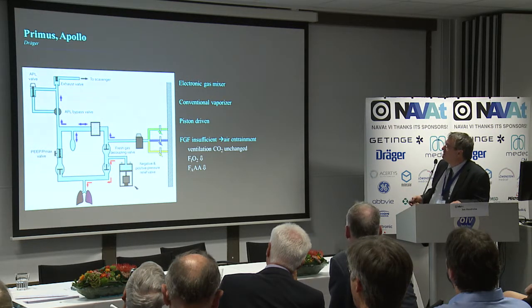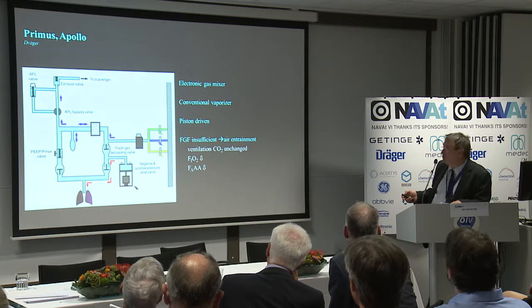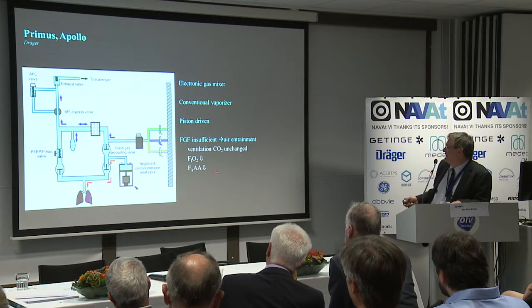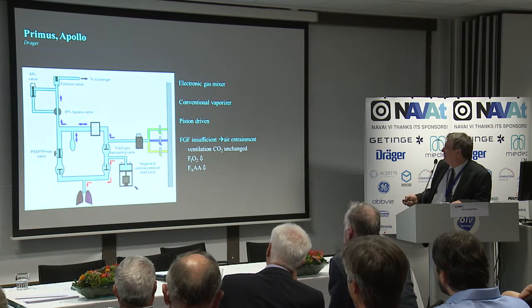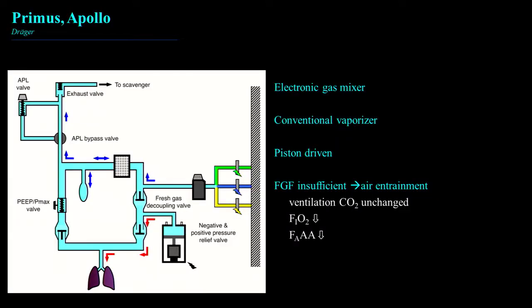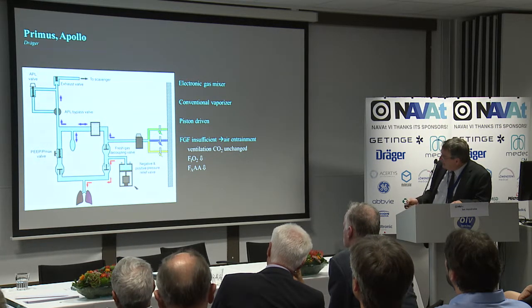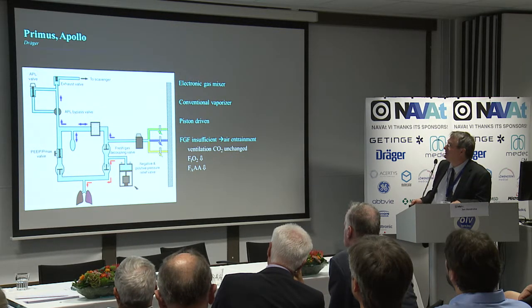Now let's have a look at the Primus Apollo. Please correct me if I'm wrong. This again has an electronic gas mixture with a conventional vaporizer. It's piston driven, and if you switch off the fresh gas flow, air will be entrained and used to ventilate the patient. Then of course you have to watch your inspired oxygen concentration and your end-tidal agent concentration, because this addition of air will have an effect on the concentration of the other gases in the circuit.